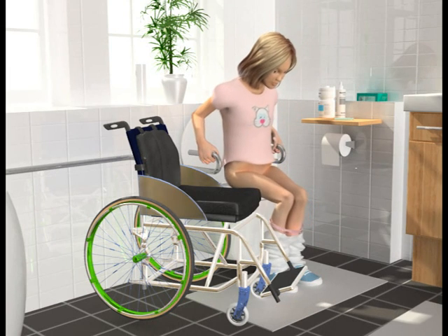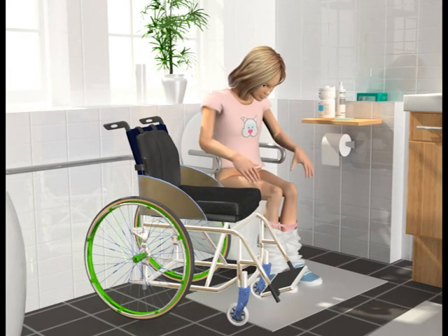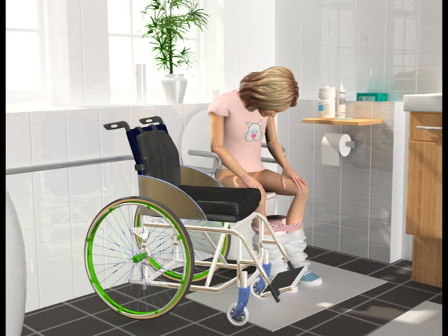Pull your pants down so you can get to your urethra easily. If it's easier for you, there's a special device you can use to keep your legs apart. If you can, always try to go to the toilet before using your catheter.